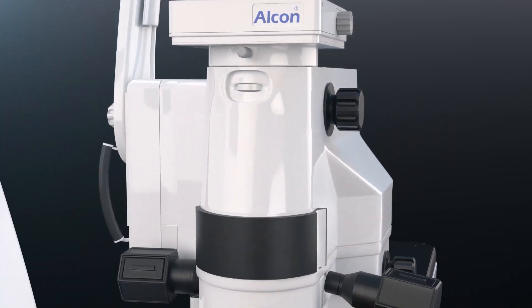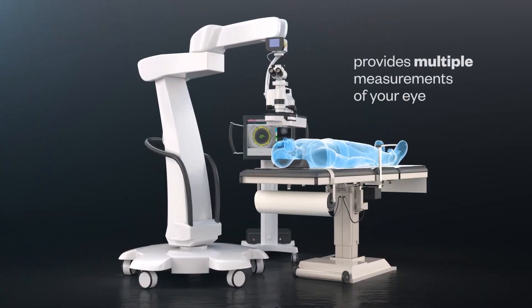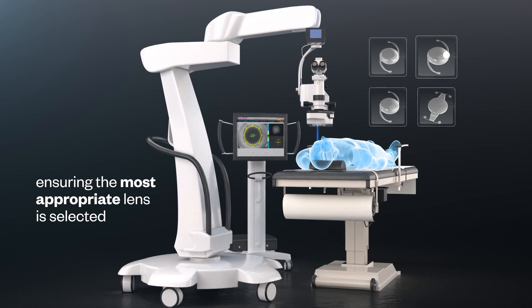This is done using Aura System technology. The Aura System provides multiple measurements of your eye, ensuring that the most appropriate lens is selected and placed with accuracy.